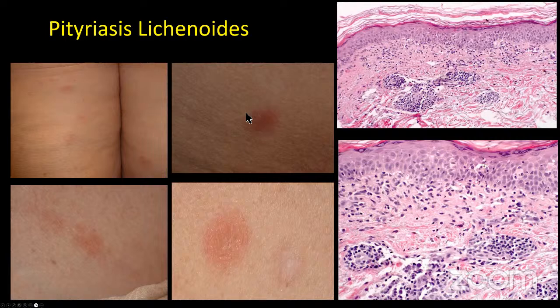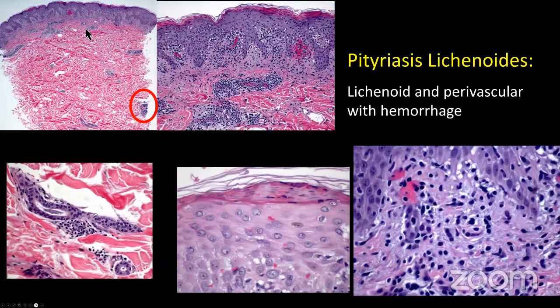Clinically, these are small lesions that become erythematous, very much smaller than nummular lesions. They dry up and eventually go away. So they will always go away, though sometimes it takes a little longer with chronic pityriasis lichenoides. We already went over the classic interface plus perivascular plus erythrocyte extravasation. Here's your clue here for the diagnosis.